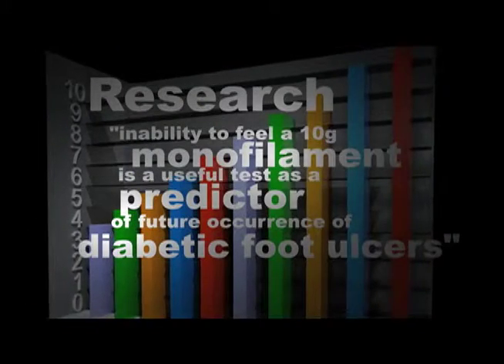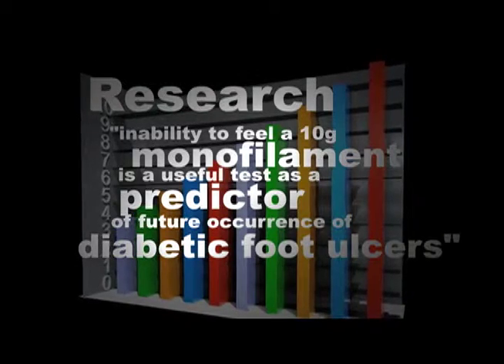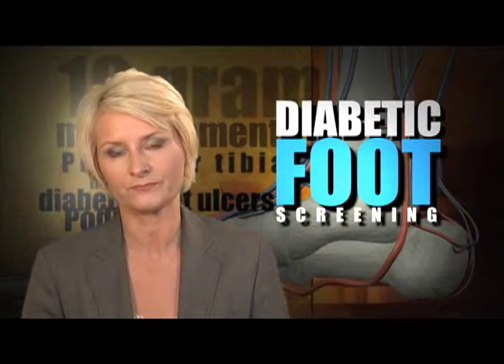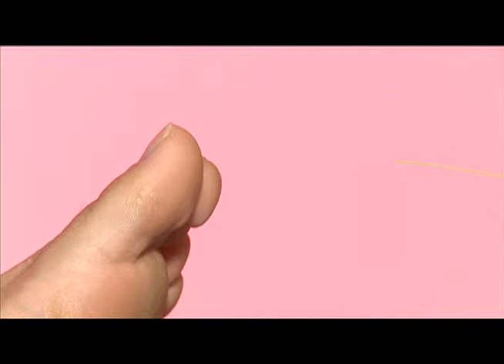Studies have shown that the inability to feel a 10-gram monofilament is a useful test as a predictor of future occurrence of diabetic foot ulcers. Inform the patient you're going to test the sensation in their feet with the monofilament. Show the patient that it's not sharp by first testing it on their forearm and then with their eyes closed as a comparison. The monofilament should be applied perpendicular to the surface of the skin and with sufficient pressure to cause a slight bend in the filament. If it's kinked, it'll need to be replaced.